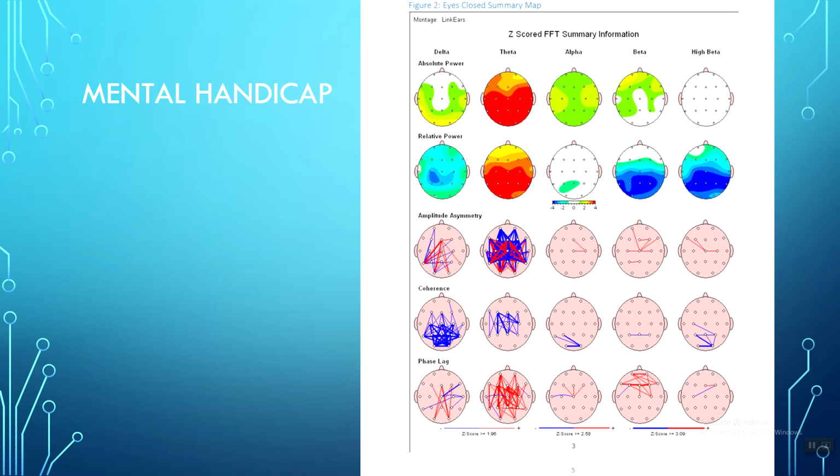Right, so if we broke it into 100% of your time, for instance, what we would say is they're spending 75% of their time doing theta and far less of their time doing delta and doing beta or high beta. The bigness of their theta totally trumps the bigness of their delta and the bigness of their beta.